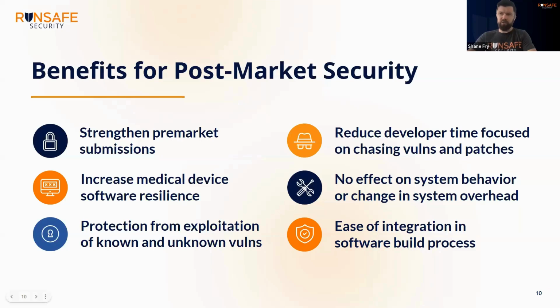Yeah. So, as we look at new, well, I say new, I'm very used to working in the world where new is anything in the last 5 years, much less, in some cases 10 years. But as we look at the current regulatory environment, being able to say that you've got SBOMs and you're doing SDLC and you're taking those SBOMs and doing vuln management with them, that's great. But if you can then say, we're protecting the device forward for vulnerabilities that might be found afterwards, you're going to really strengthen that pre-market submission. And so that should be useful for reducing your time to market.